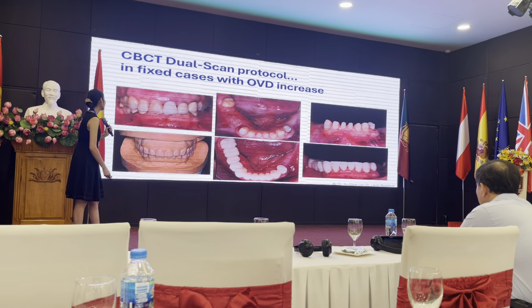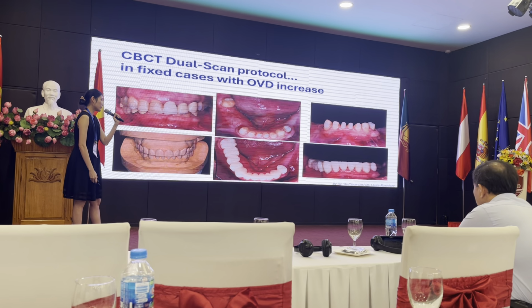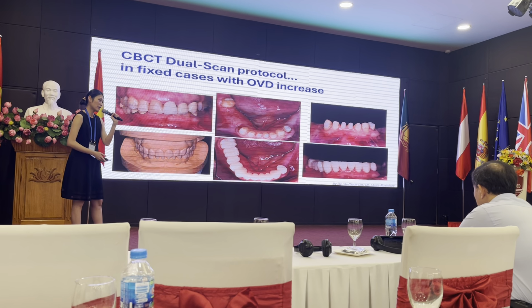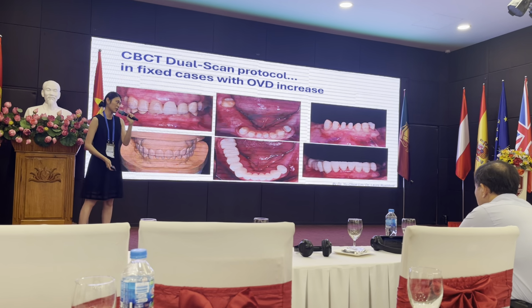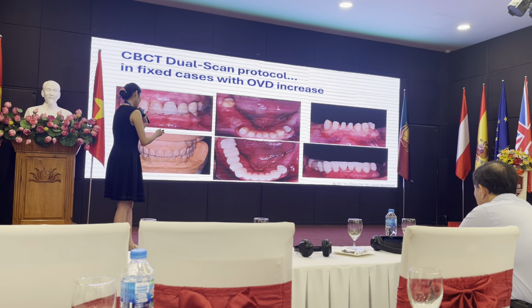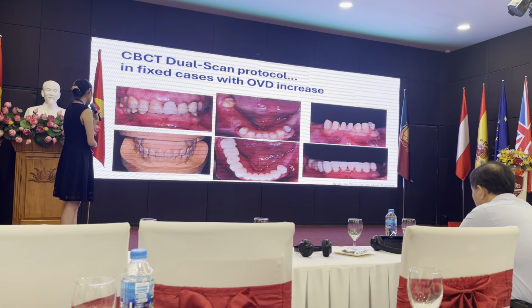Cái trường hợp này thì sau khi chúng ta wax xong, chúng ta có thể trồng nó với các cái răng tự nhiên của bệnh nhân để chúng ta quan sát được cái khoảng cách chúng ta có so với cái phục hình implant tương lai. Trong những cái trường hợp mà chúng ta muốn thay đổi cái kích thước dọc của bệnh nhân thì CBCT dual scan này là một cái công cụ rất là hữu hiệu.